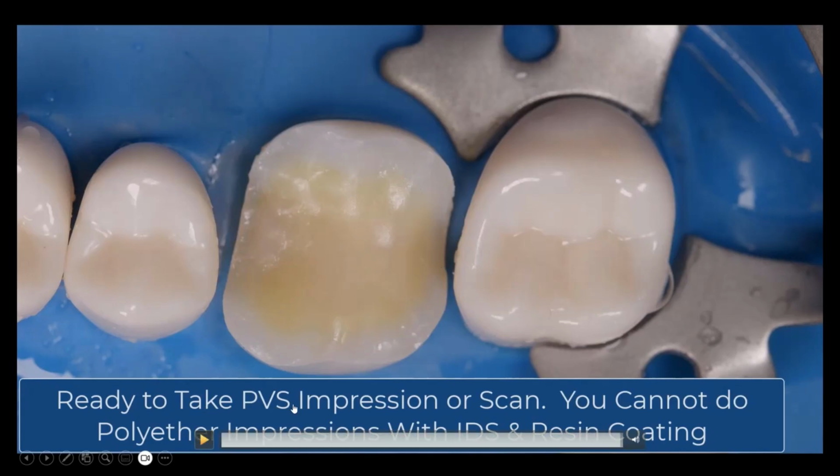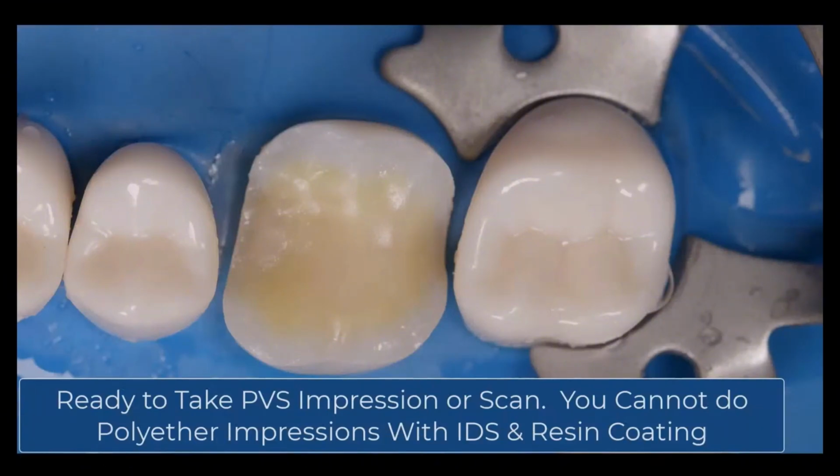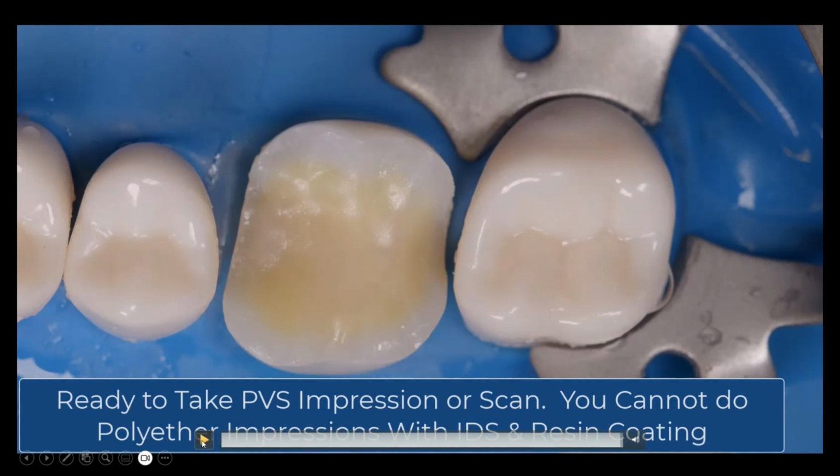You can only use a polyvinyl siloxane impression or scan. I'm assuming the majority of you are scanning. If you're still using traditional impressions, man, I encourage you to talk to the lab here and have them talk about their successes. They've been involved with scanning for a very, very long time, as I have. So you can call and ask me questions as well. It doesn't cost an arm and a leg to get a scanner, and your ROI on that is amazing. And your stocking of impression material just goes away. Okay, does that make sense what we just talked about? That was the IDS and resin coating.